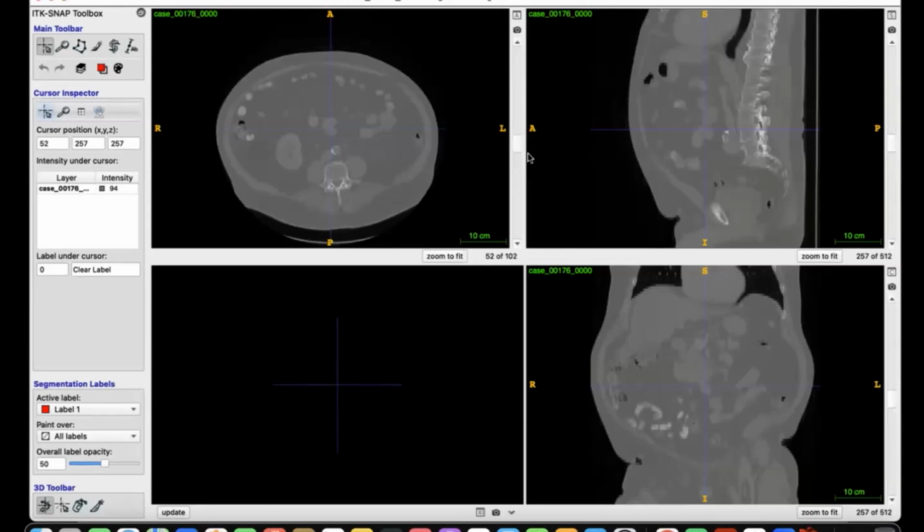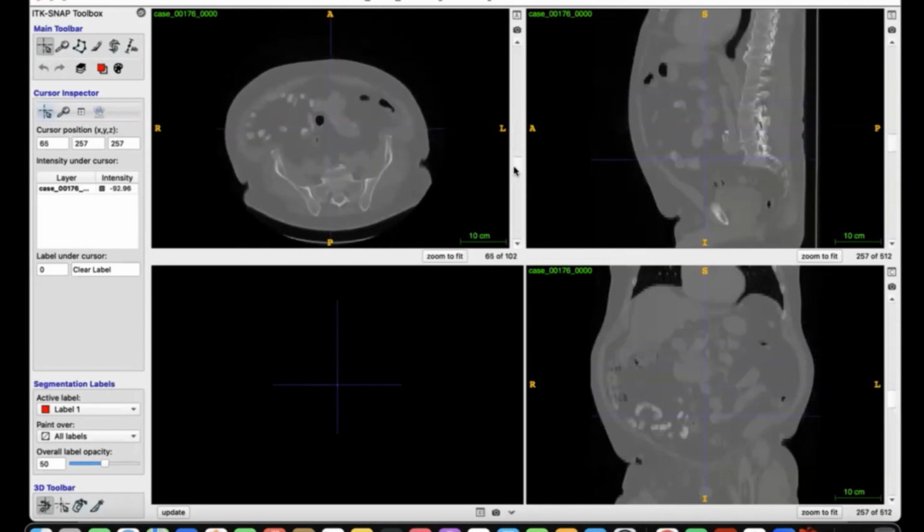And let's look at, as I told you, this example image for kidney tumor detection or segmentation. This patient has a kidney tumor here. Now we are just loading the original image. One thing I want to show you is that using this toggle, in each of the quadrants you can see these bars, and you can move them.